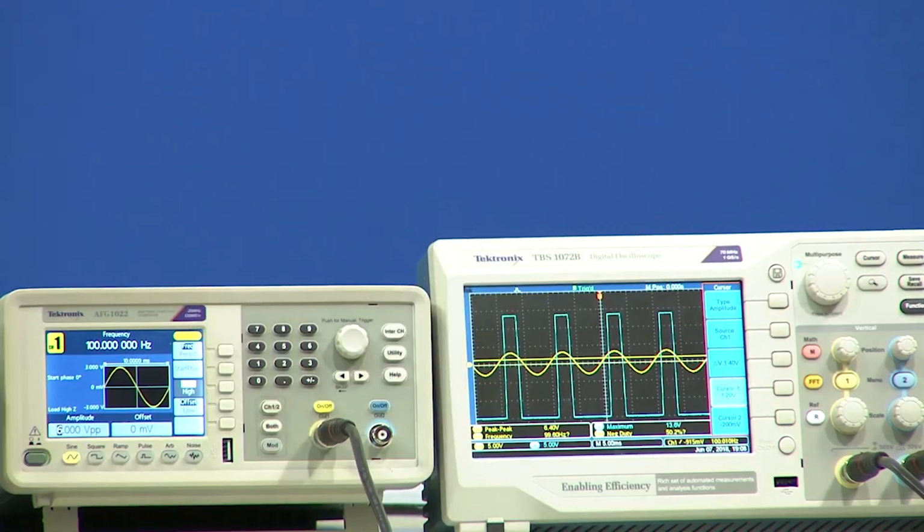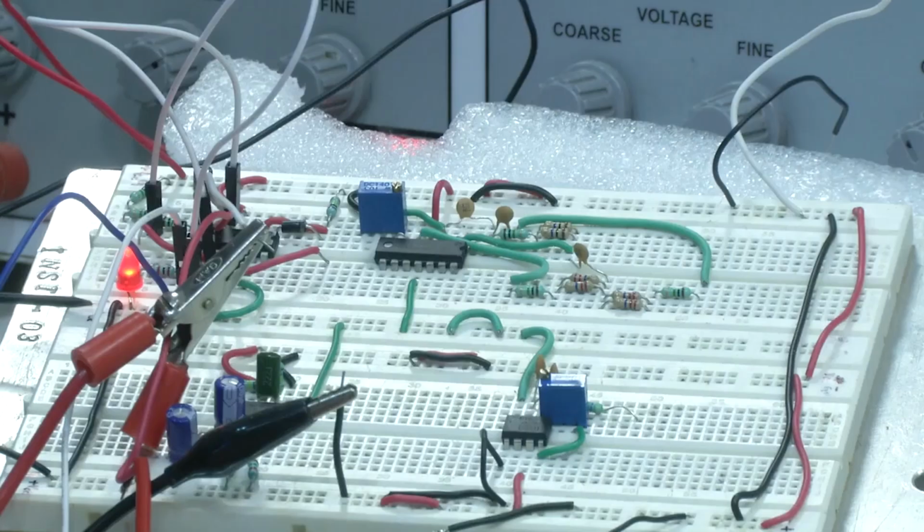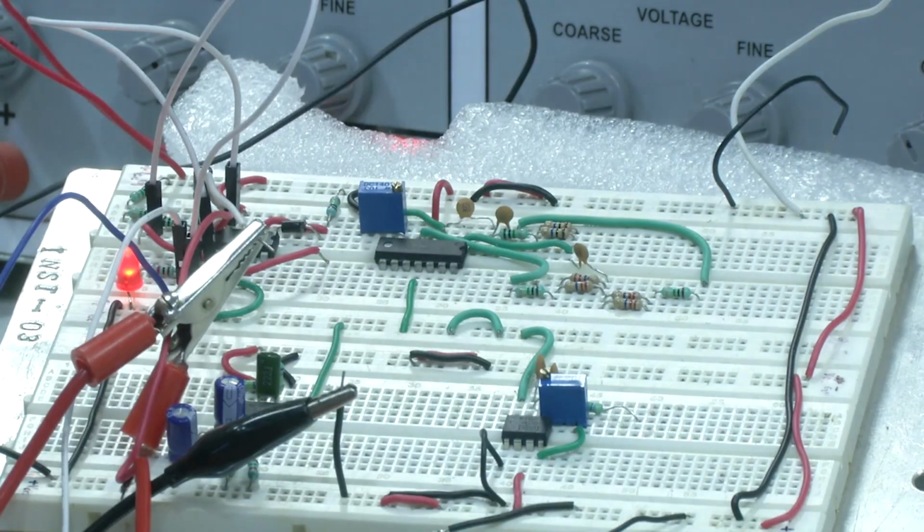But when we look into the board, we can see the LED is continuously glowing. We cannot see any flickering of the LED, like on off on off. The reason is the frequency. The frequency that we applied is 100 hertz, which is very hard to follow with our eyes. So, what I will do is change the frequency to human understandable values, somewhere around 30 or 20 hertz, where we can easily visualize it.